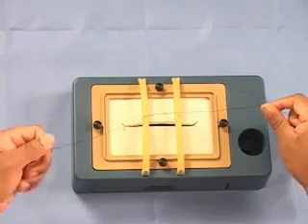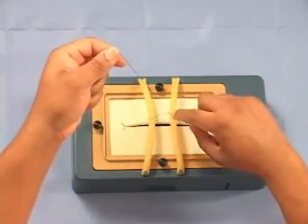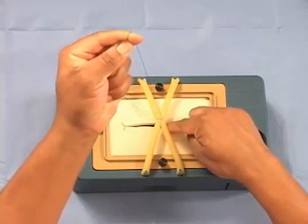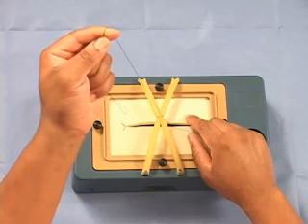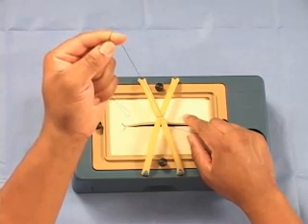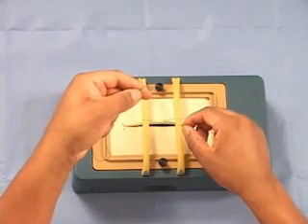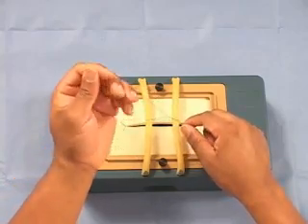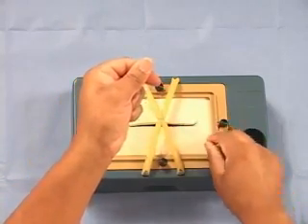To do this throw correctly, you will pull up with your left hand or posting hand and push down with your index finger of your tying hand. Now, let's identify which hand we should pull up with. If I pull up with my left hand or posting hand, notice that the knot stays in place. If I pull up with the other hand, notice that the knot has become unraveled. So, maintain your tension with your posting hand. I am currently pushing with my index finger.